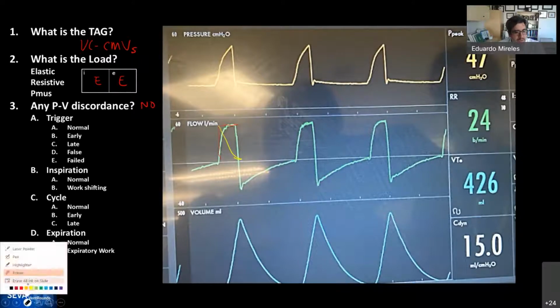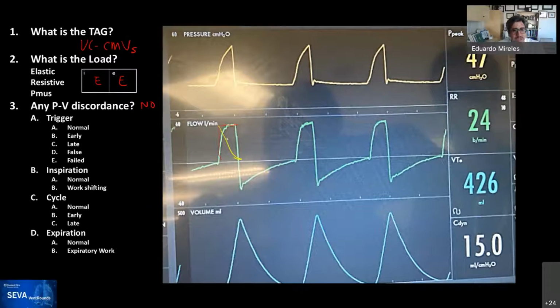Normally, what you would expect to see on a patient like this, I'm going to do it on this one so that there's no glare, is that this should go up rapidly, and then it should go like that. That's what you would expect to see, a straight shoot up, and then the compliance part, which is the slope of the curve. Because they changed the rise time, this doesn't rise as fast as it should. Does that make sense, Udi?